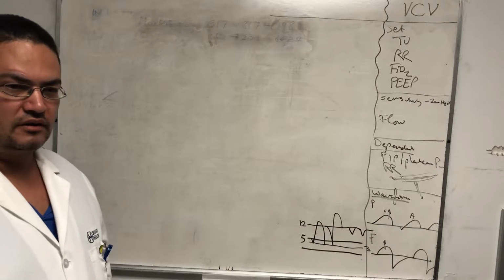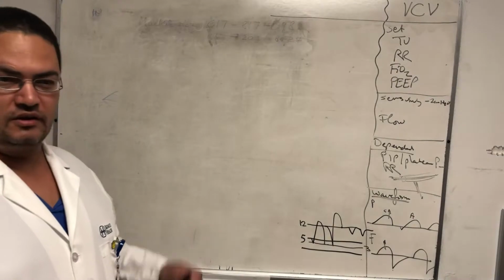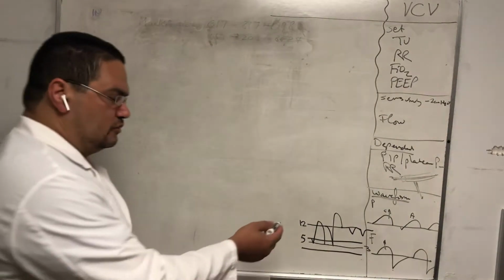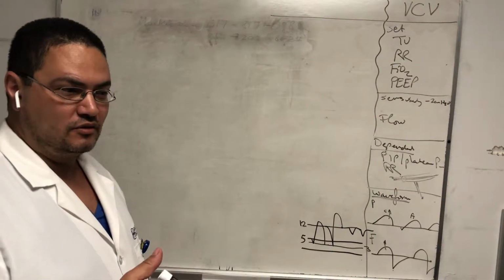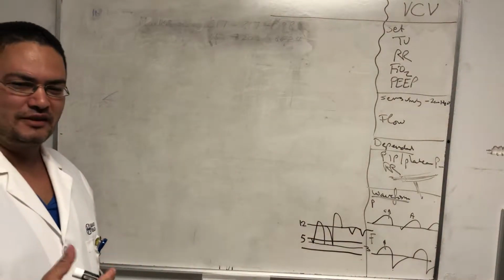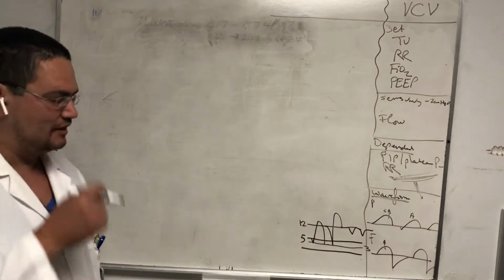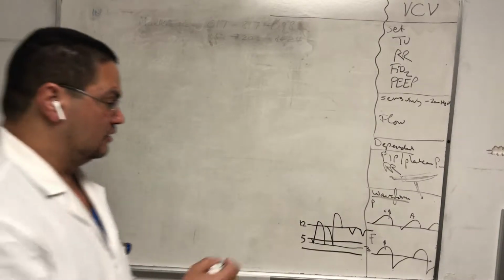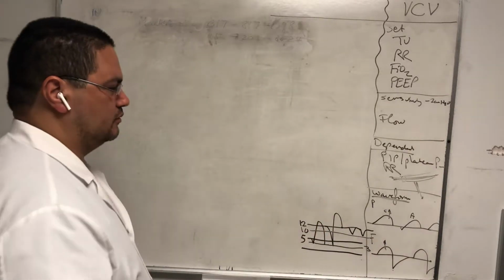It wasn't that they had any physiologic problem with their lungs. It's just the interaction between them and the vent. So at that time, what we used to do was paralyze the patient briefly, measure the auto PEEP, and match the auto PEEP. If you talk to some of the old pulmonologists, they'll ask, did you match the PEEP? Well, this is old. This doesn't happen anymore. So we used to match the PEEP, giving a PEEP of 12, and that fools the vent into thinking that it should trigger at 10. So the patient will be comfortable.